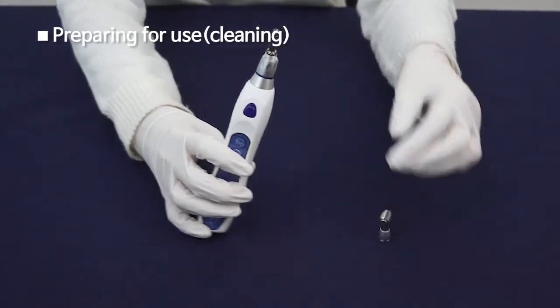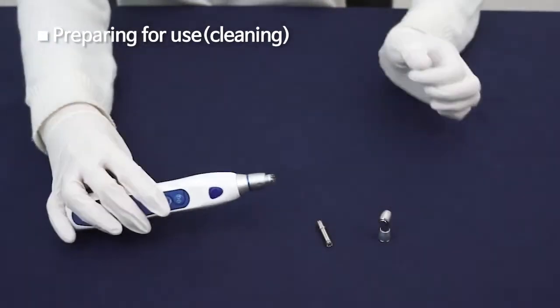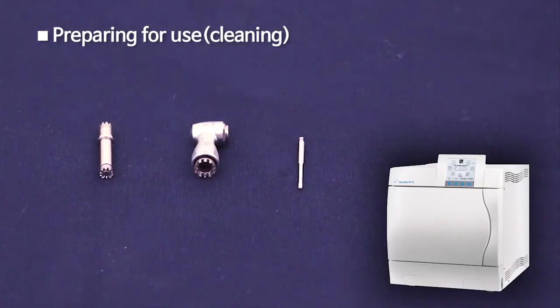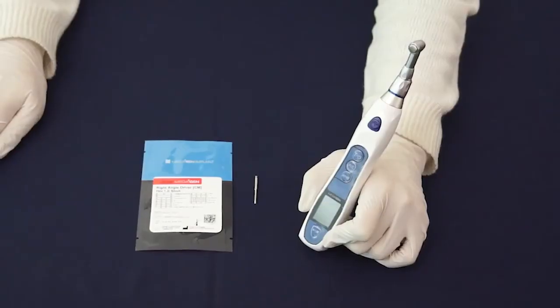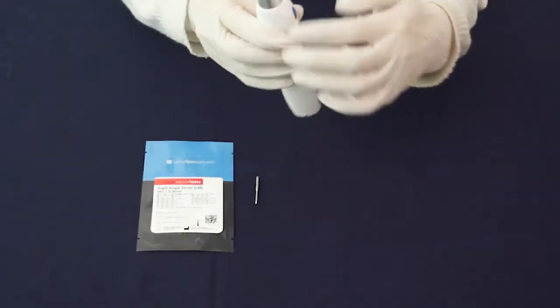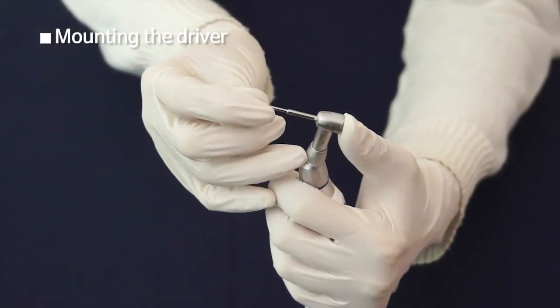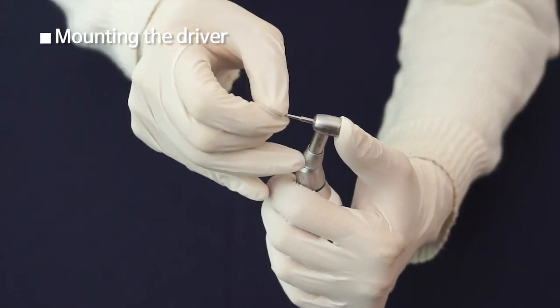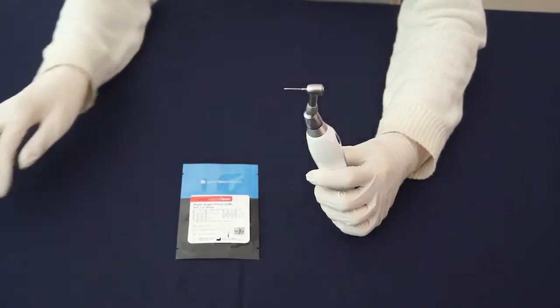When using Meg Torque, please cover the main body with sterilization vinyl to protect it from contamination or humidity. Press the upper side of the contra angle head and connect the screwdriver gently with a ratchet. Make sure to connect the tip correctly before use, and check the screw groove to connect properly.